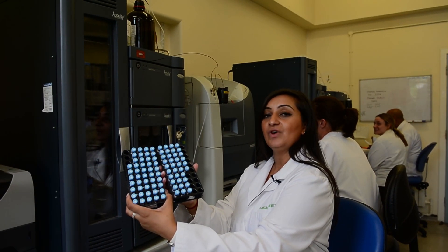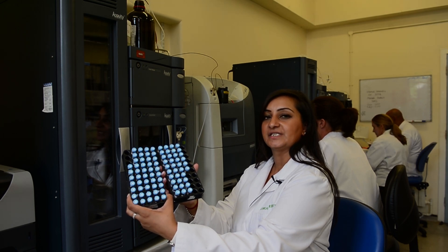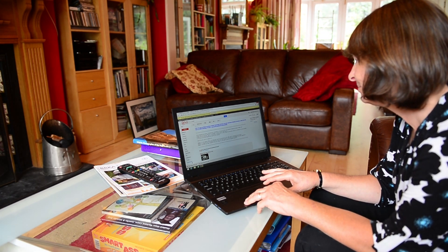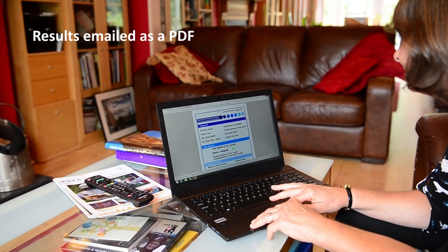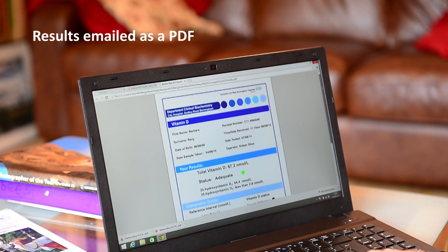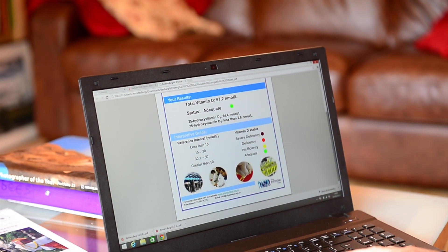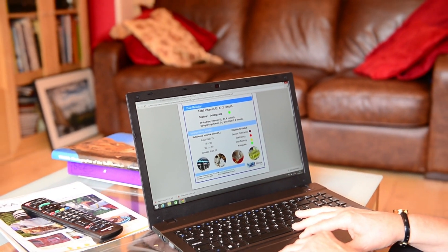Here are the samples ready to be loaded onto the liquid chromatography mass spectrometers. It's five days later and Barbara is looking at her emails to see if her result has arrived in her inbox. As you can see, your result comes as an attachment on your email. This style of report includes a traffic light system designed to help you interpret the result. If you need to discuss the results with a professional advisor, it is clear on the report that your sample has been analyzed in an NHS laboratory.